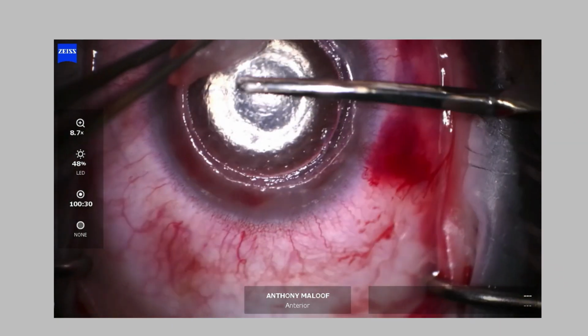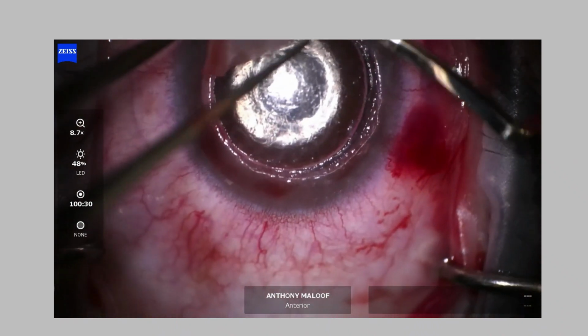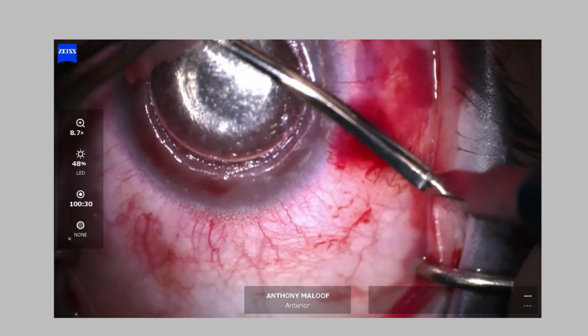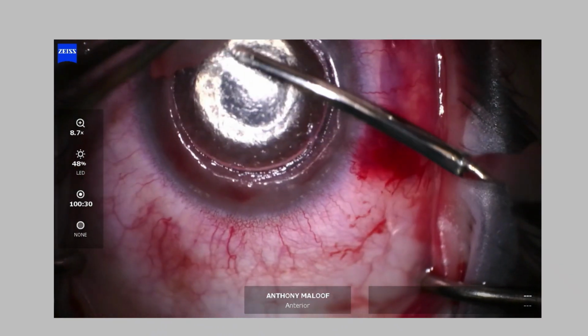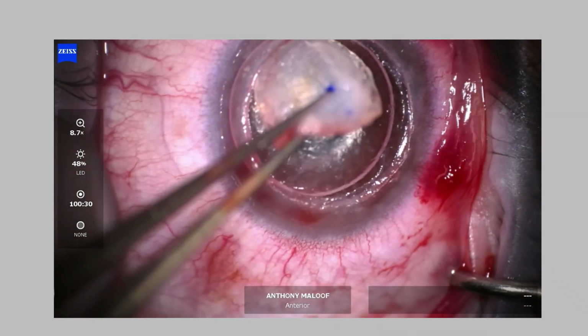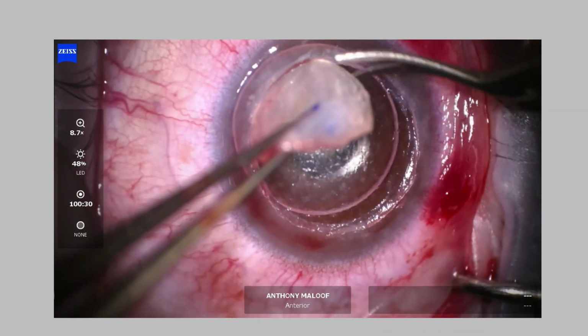It's easy to dissect this portion that's far away from your hands simply because you're doing it from the top down. Very hard to do it right from the sides. Using direct vision is always better. And there we go.